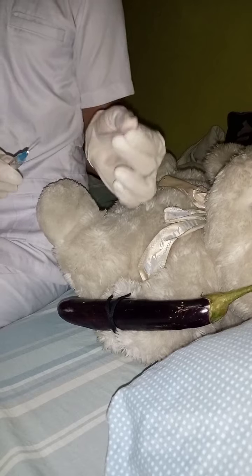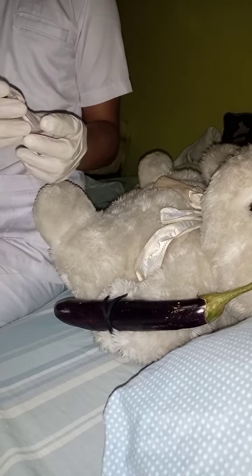So now we just need to uncap the syringe, and after that, discard the cap.